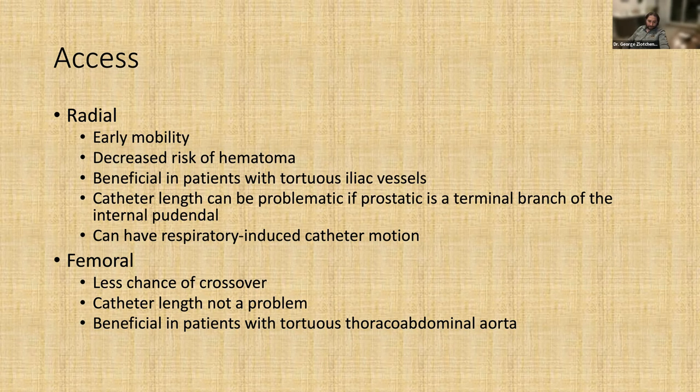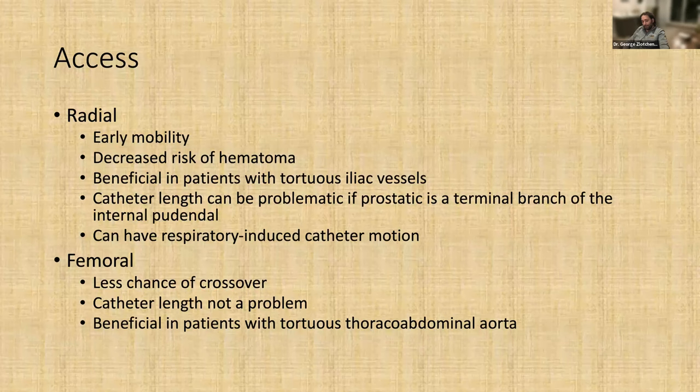With femoral access, catheter length is not a problem. It's also beneficial in patients with tortuous thoracoabdominal aortas. So that's another benefit of having a CTA before your procedure. You can see how tortuous their arteries are. And I have had patients who had a horizontal appearing common iliac artery, which I know is going to be very difficult to get good pushability from the wrist. So I do them femoral.